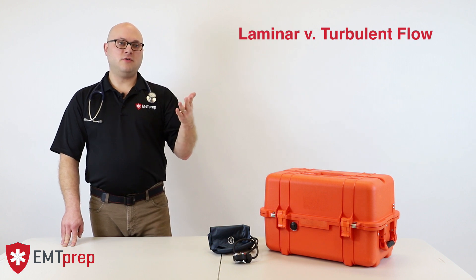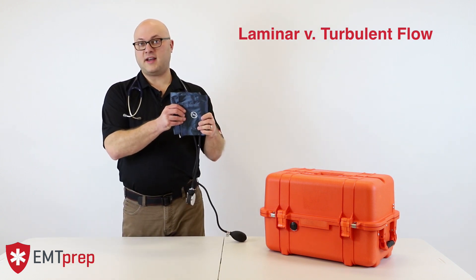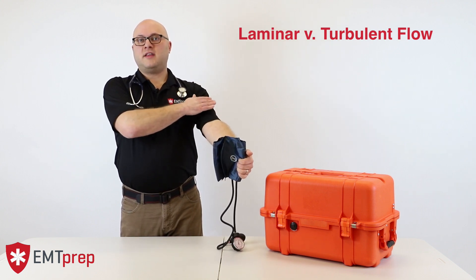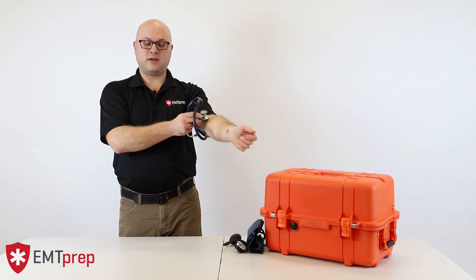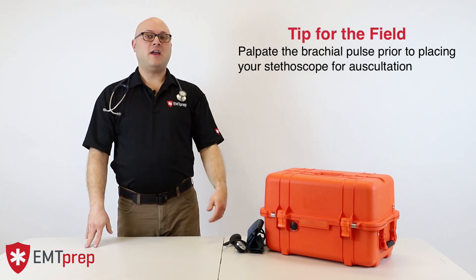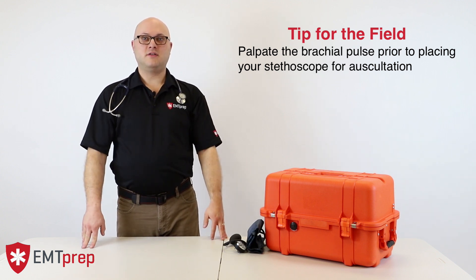The blood pressure cuff, which has to be appropriately sized for an accurate reading, is wrapped over the upper arm in such a way that the bladder will occlude the brachial artery as it's inflated. We then take our stethoscope and listen over the brachial pulse point. A helpful tip: physically palpate the brachial pulse before placement of your stethoscope head.